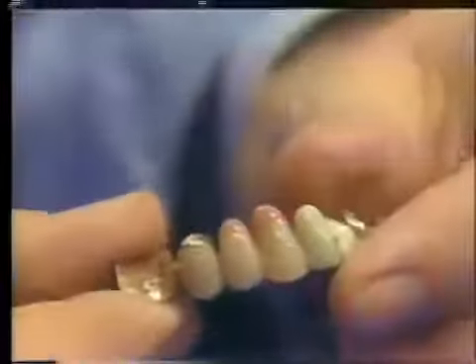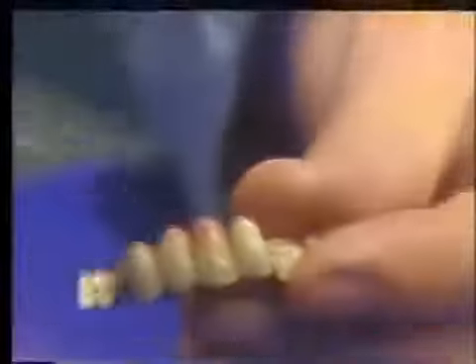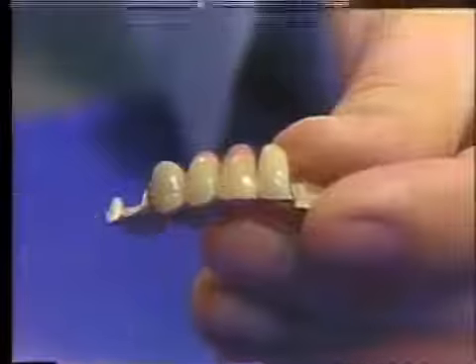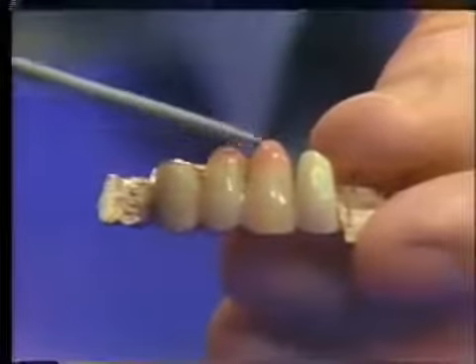It's necessary, of course, to grind these facings to adapt to the particular case in which they're being utilized, and I'm not going to show you that in this particular presentation, but you see here a bridge which has long pin facings already on it, and the Pontics are this tooth here and this one. These are the two long pin facings. Now these are rather long teeth. This is for an older patient who had some rather severe gingival recession, and you can see that there is a little pink coloration at the top here.